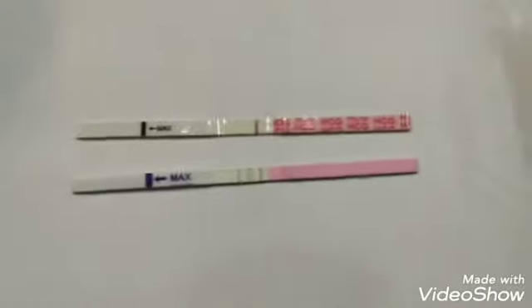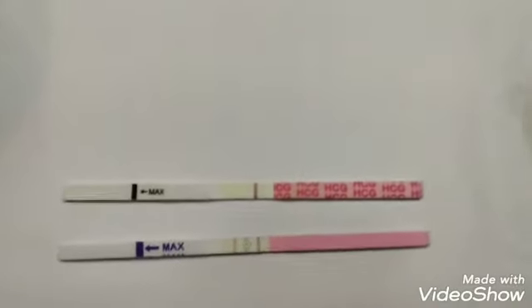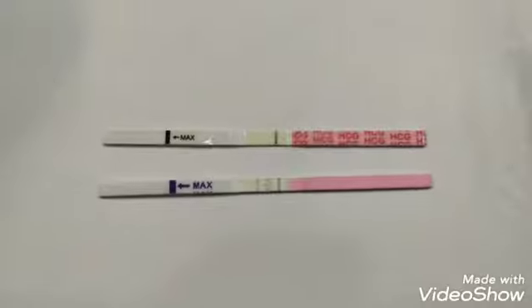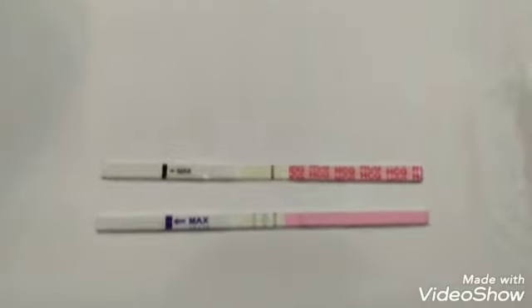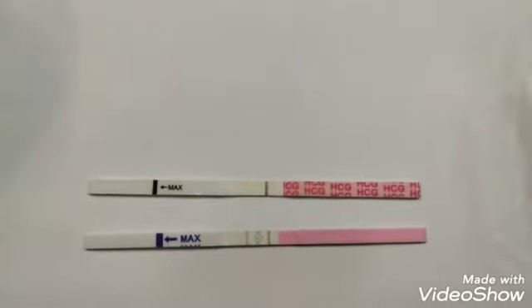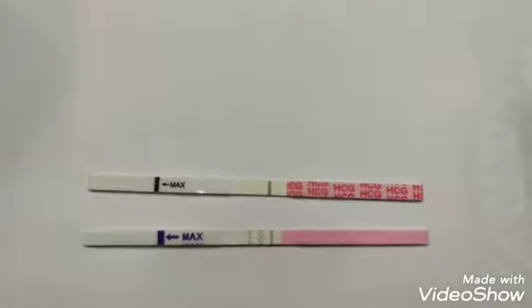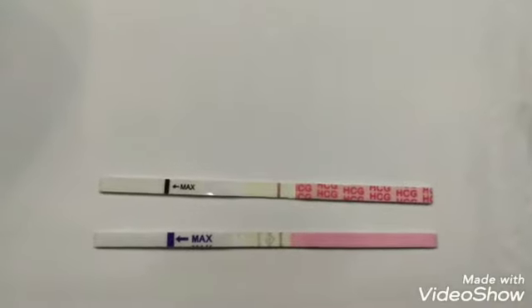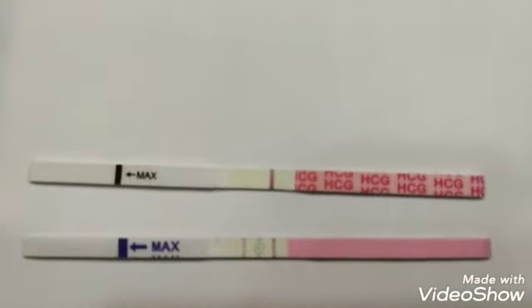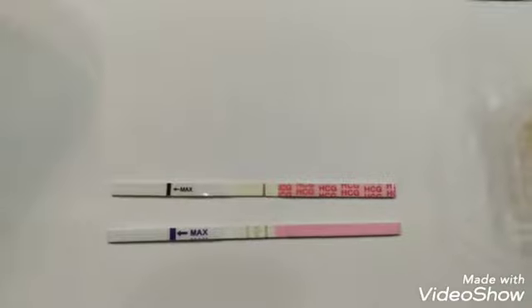Sorry, my hands are very shaky. I'm trying to keep it still, but I'm very close up on this. The top one is actually, the bottom one is the David brand OPK. The top one is the Wanfo. Yes, I did waste one of them just to try and see what it looked like, because some people said that it seemed like they could see an indent or a very, very faint hazy line. As you can see, I don't see that at all. So, very negative on that test, which is what I expected.